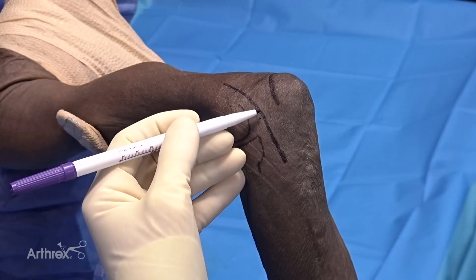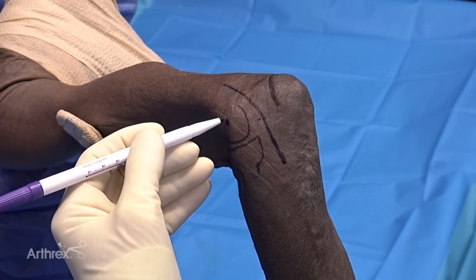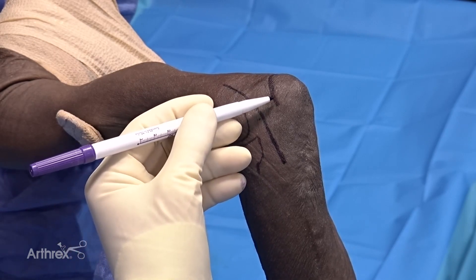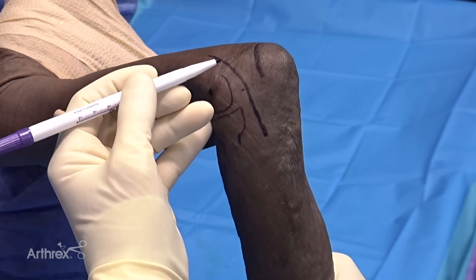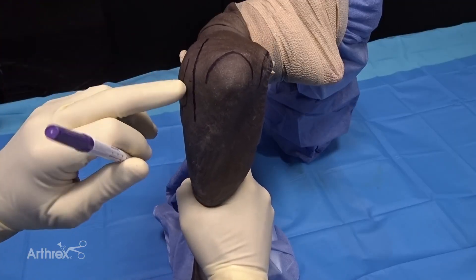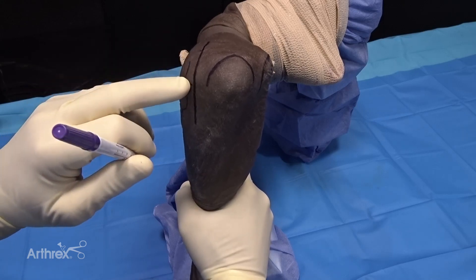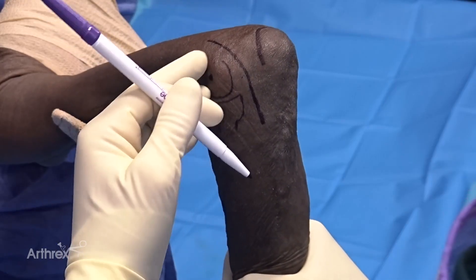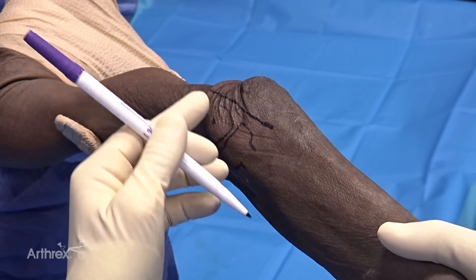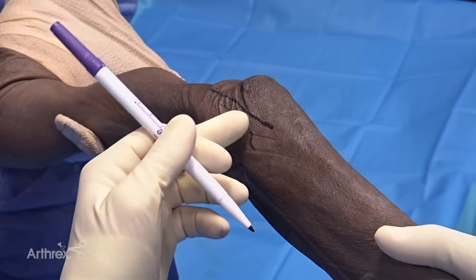The incision for the anconeus splitting approach is equidistant between the lateral epicondyle and the lateral border of the olecranon. As we flex the elbow we can more clearly see the borders of the capitellum. Once the line is drawn it's important to extend the elbow to make sure we have a linear incision.